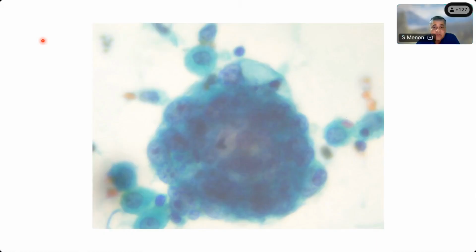I've just put this random picture after this CT scan. Yes, sir. So this FNAC picture is showing a cluster of highly atypical malignant cells with irregular nuclear contours, prominent nucleoli and variable cytoplasm. Very good, Ranil. But did I tell you this is FNAC? Sir, it's looking like FNAC. So how do you diagnose?